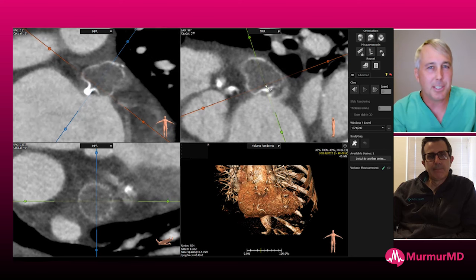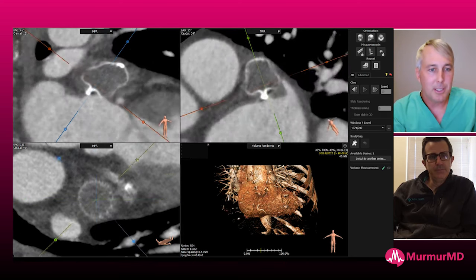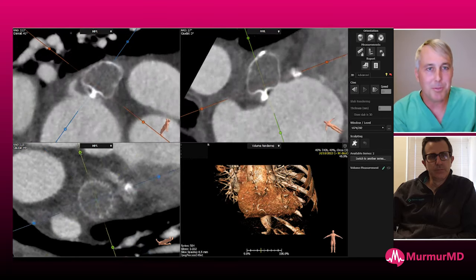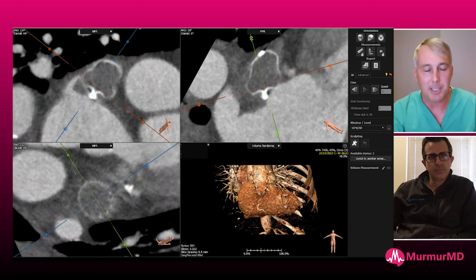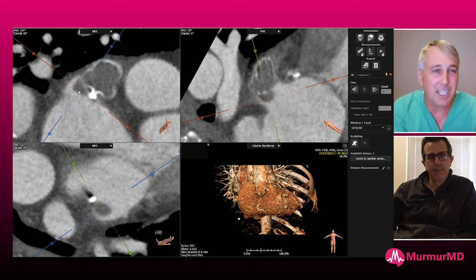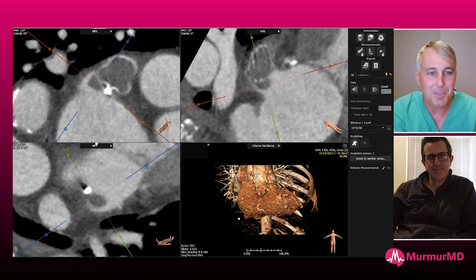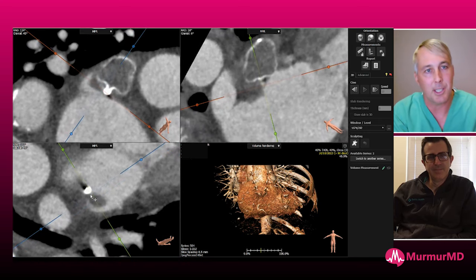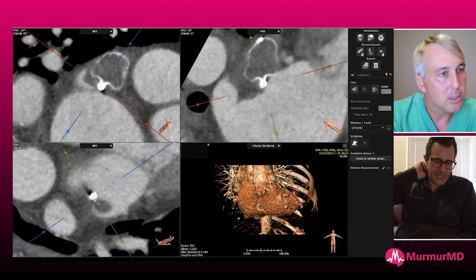We had a case that was a very persistent thrombus, and we ended up putting the patient on warfarin and Plavix, and it went away. But that's certainly unusual to need those. It seems, now that we're doing a whole lot more CT, I think you find a lot more stuff. I'm curious, did we miss things previously on TEE? I don't know. Yeah, I think probably. I mean, my uneducated opinion.